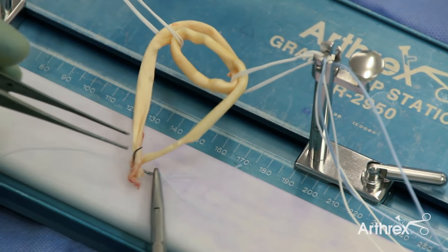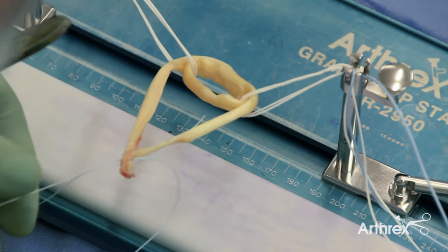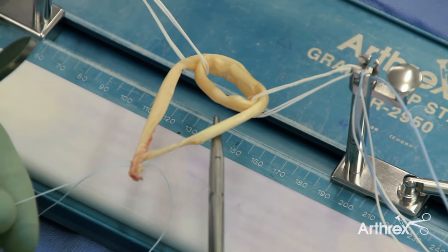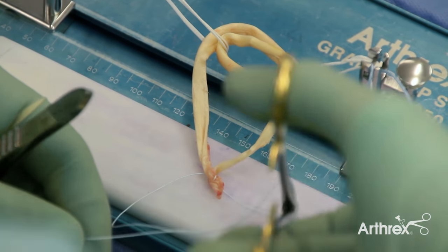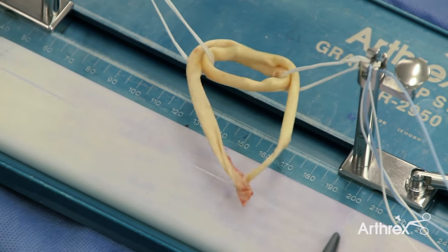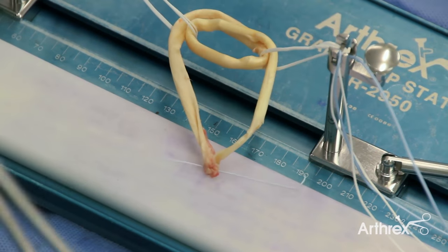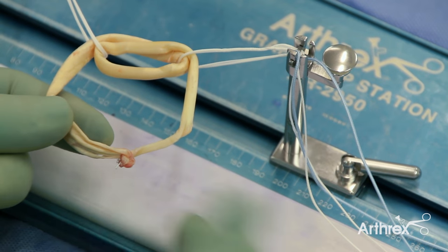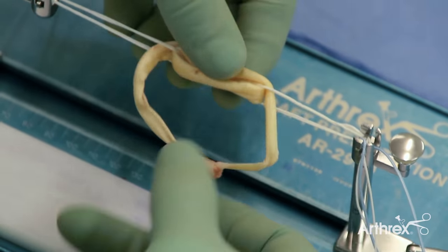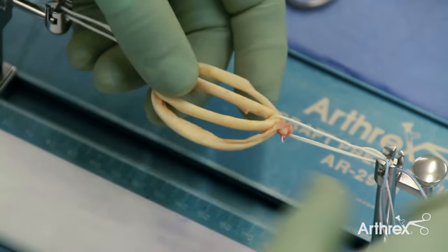These two free ends are then sutured together with a mattress suture using zero fiber wire. In isolation, the pullout strength of this knot is not great, but once it's been incorporated into the graft link, we've tested the pullout strength and the construct fails at approximately 80 newtons. This means that the graft can be manipulated and gentle tensioning carried out without concern the knot will fail.